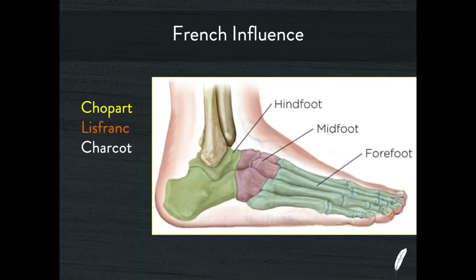The next concept that I want to introduce is the concept of the lines of weakness inside the ankle and foot apparatus. So the foot is a very French place with names like Chopart, Lisfranc, and Charcot, which of course are all French words.